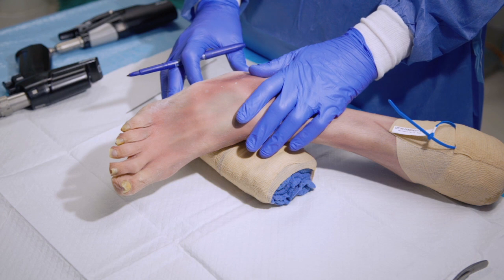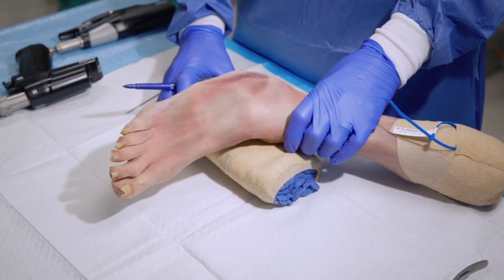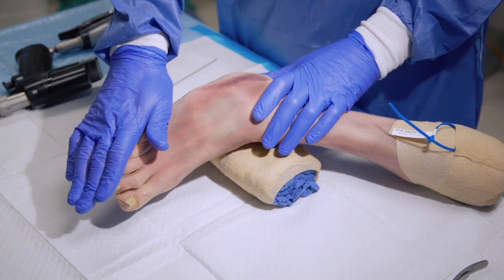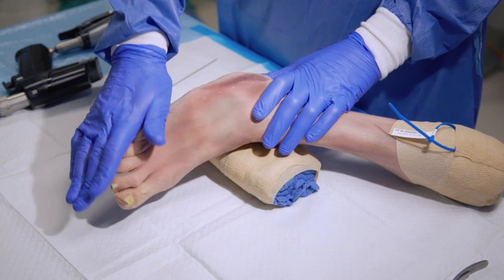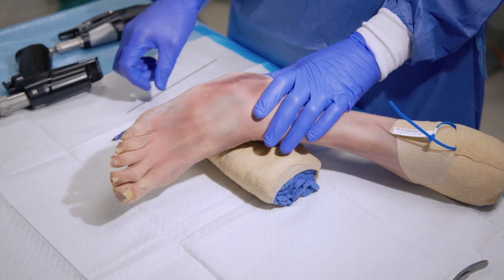I believe the easiest approach is to have the patient placed in a lateral decubitus position. This affords the ability to place a bump under the heel, and then you can actually put a little bit of leverage on the forefoot, which will help to open up the fifth metatarsal cuboid joint.